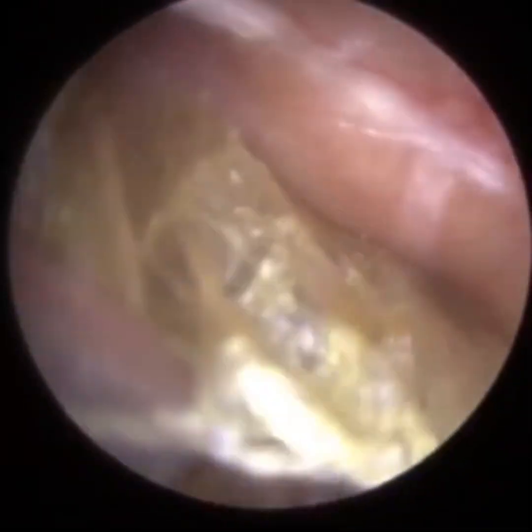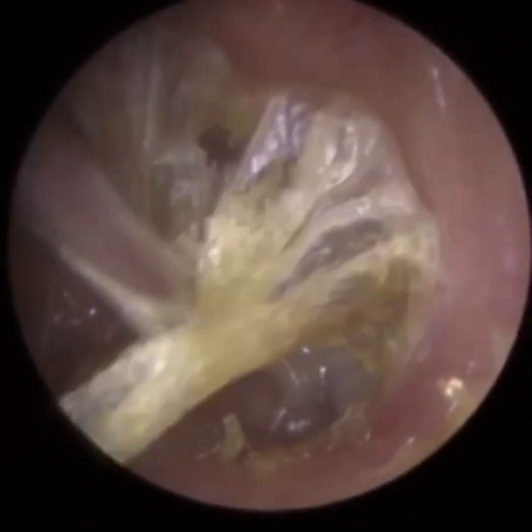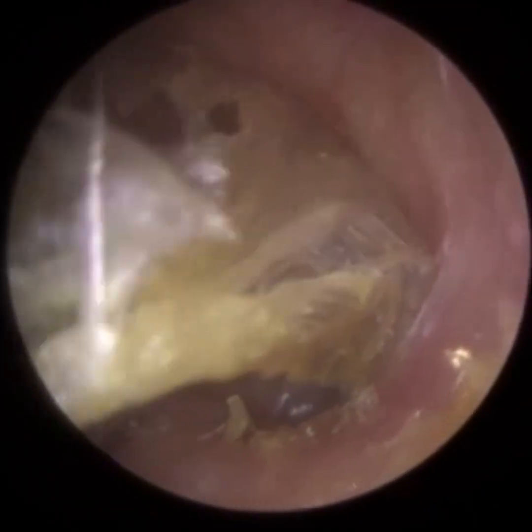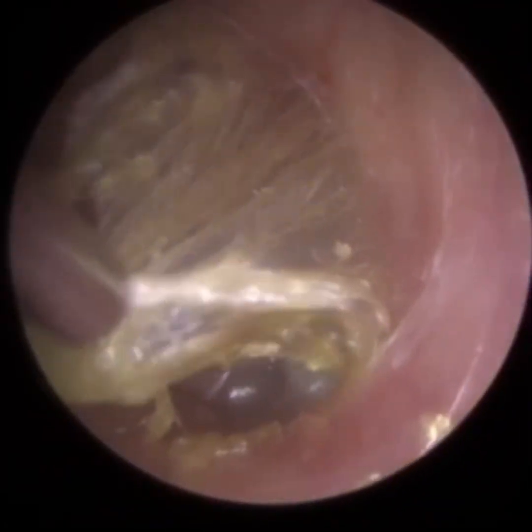So depending upon the severity of the cholesteatoma, of course, a CT scan is normally performed by ENT surgeons so they can see the extent of the skin growth of cholesteatoma in the middle ear. So what they do, they can open up the flap of the eardrum through the ear canal, lift the eardrum forward. So going to come back to that.